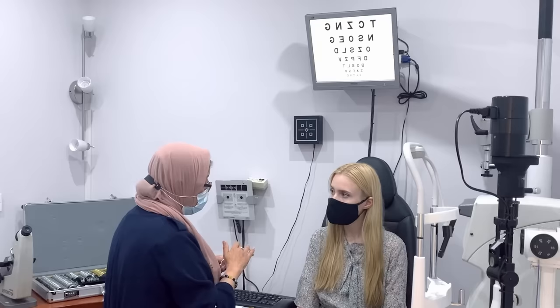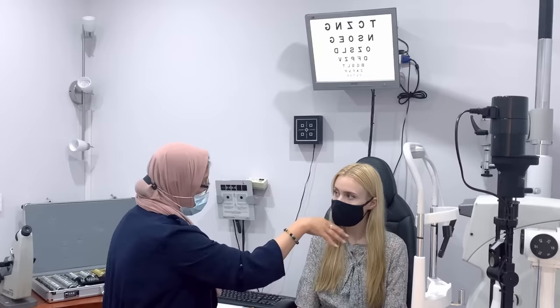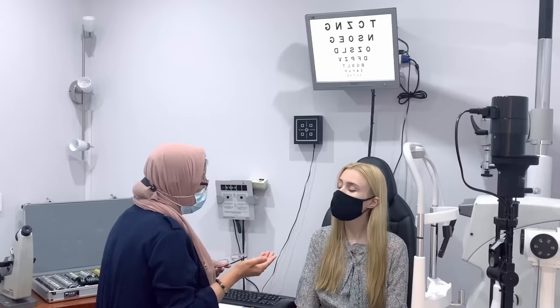So the top part of your lens is for the distance. But as you traverse downwards to look at your intermediate, like digital, meaning computer, and close, you get a softening focus in the power in order to help that ease of vision. So they're called digital device lenses. That could be something we could look into as well.